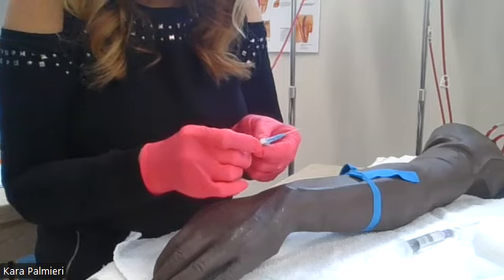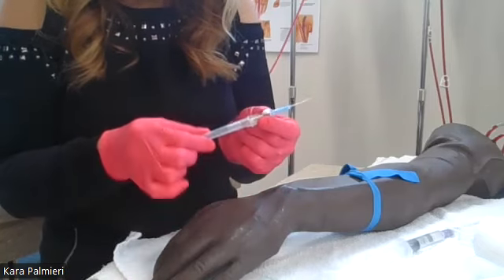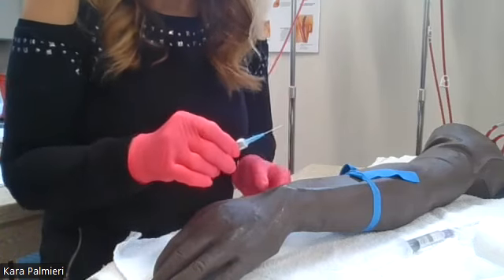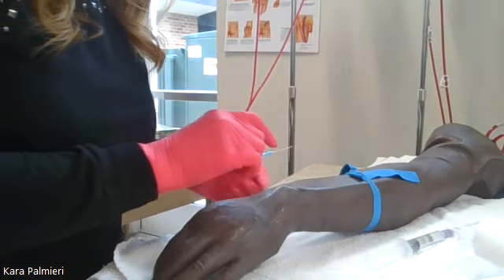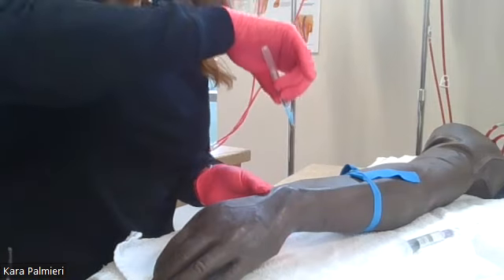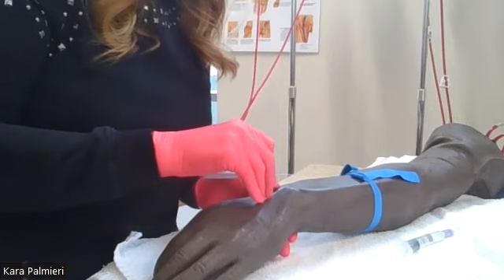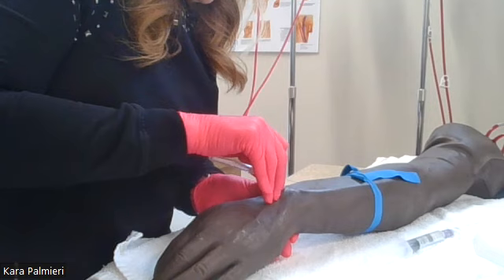When I get into the vein and I push this little white button, it will suck the needle down into here. And then all that will be left is the plastic cath. Okay. So I'm going to enter the skin nearly flush with it. So I'm not going to go in like this at a sharp angle. I'm going to go in almost flat with the skin. So I'm going to start my needle.